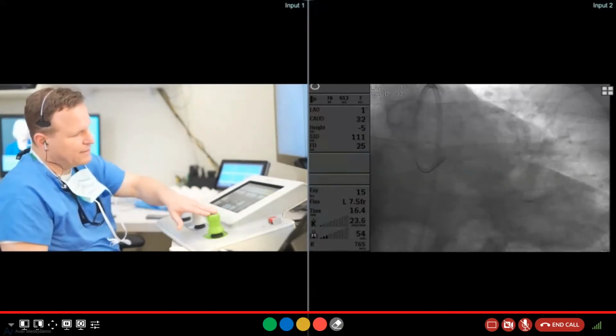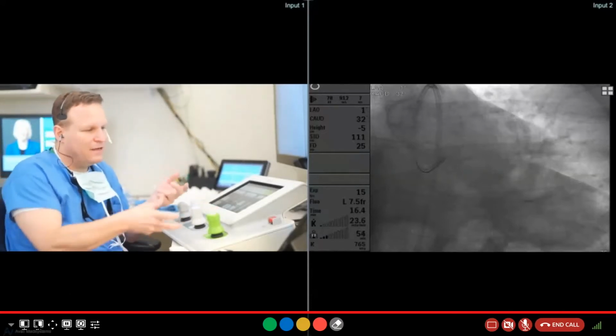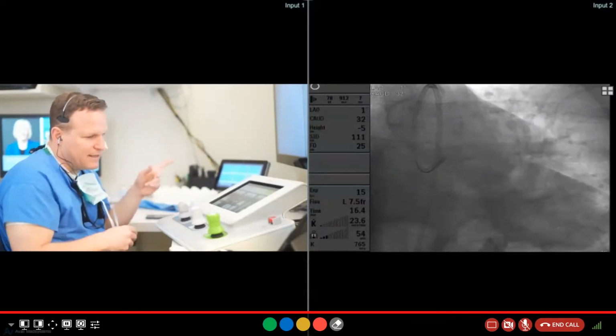guide catheter here. This was a really nice advancement going to the CorePath GRX system, and how many times you need to manipulate your guider while you're wiring. So hopefully here we can give a good demonstration of this. And if you're okay with it, we'll go ahead and get started.